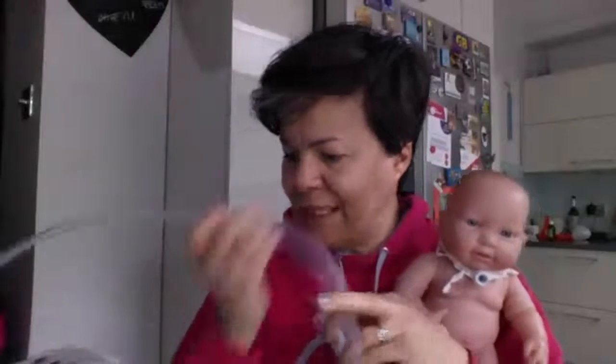Anyway, imagine that Dora's coughing. You would hear that there was something inside there that needed suctioning out. Imagine it being like a bit of snot. You would open a tracheostomy catheter like this. Now, this is where I'm going to have to use sound effects by my mouth because Zoe is at school and has her portable suction pump with her. And I only have a massive Sam 12 upstairs, which is this massive, heavy thing, and I didn't really want to bring that downstairs. So hence, you're going to have me doing sound effects. Imagine that you had a suction pump here and you pressed it on.